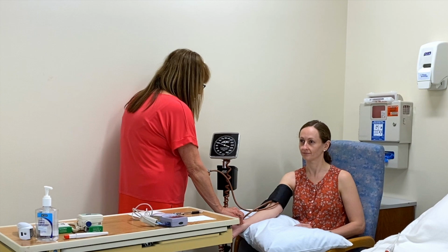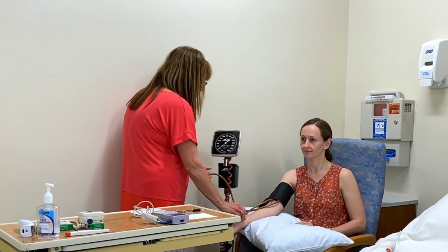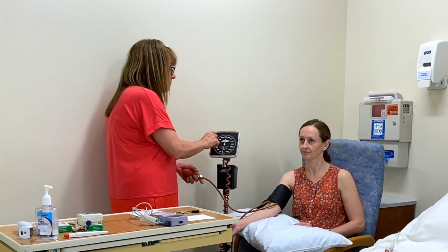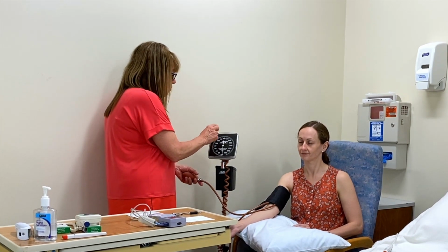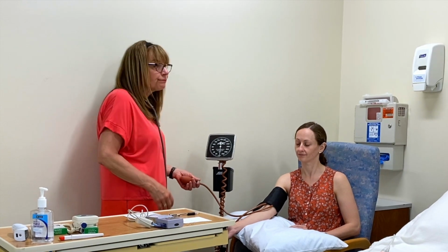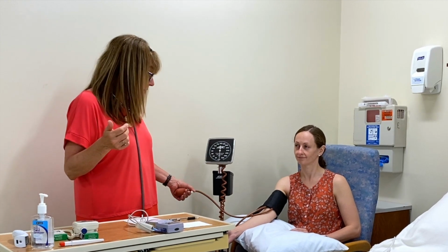And when I no longer feel her blood pressure anymore, I'm going to let it go. I no longer felt it at 110. So I'm going to pump it 30 above, up to 140. Okay? Now, why do we do this? So that we don't overinflate this tourniquet. Above 160, 180, it is uncomfortable and it hurts patients.